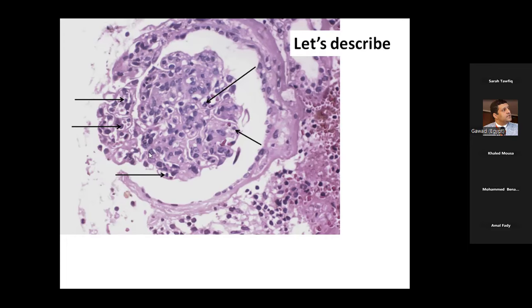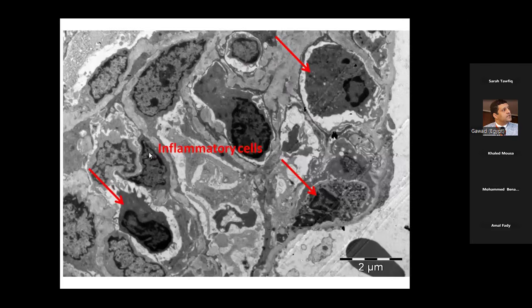These are neutrophils. So these are inflammatory cells that are totally different from the injured endothelial cells. Okay. Again, an EM picture. Can you see the difference between these cells and the resident injured endothelial cells? These cells have a darker, smaller nucleus again. Its cytoplasm is smaller, but it has these black dots.